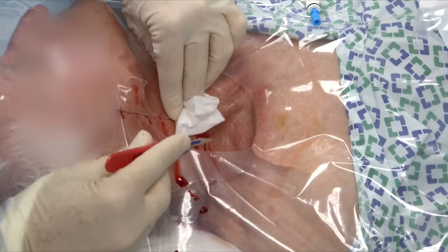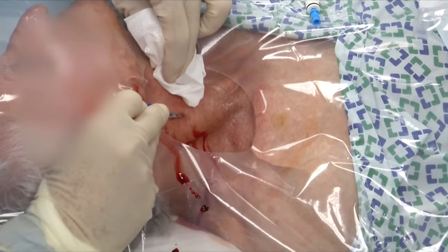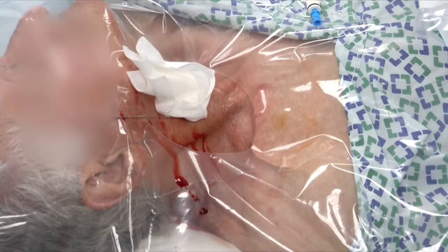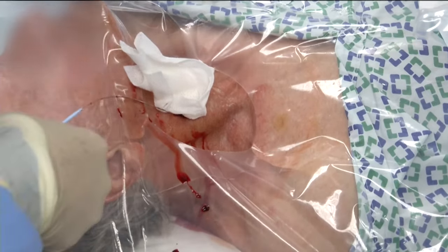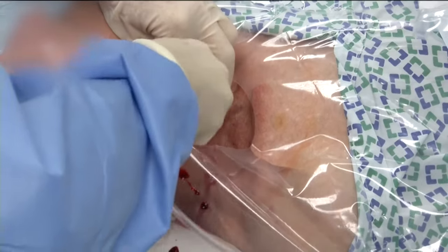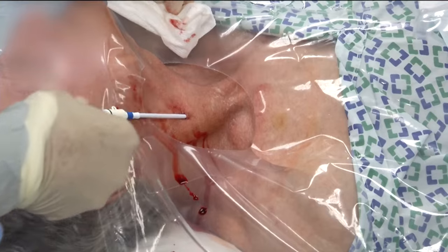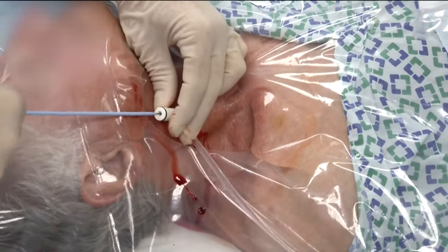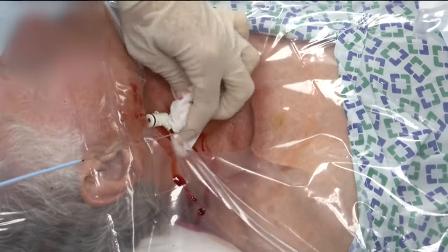Following this, a 3–4 mm incision is made adjacent to the wire using a number 11 scalpel blade. Care must be taken not to cut the guide wire. An 8.5 French introducer sheath with dilator assembly is inserted over the wire and into the vein. It is imperative that the wire and dilator assembly are removed from the patient at this point, leaving the introducer sheath in place.